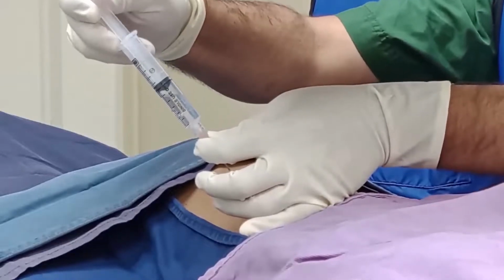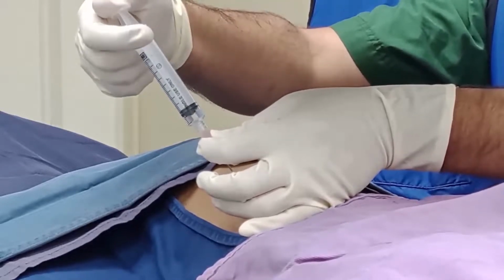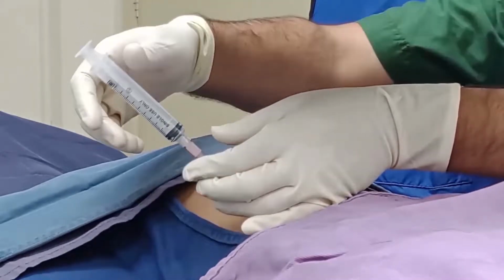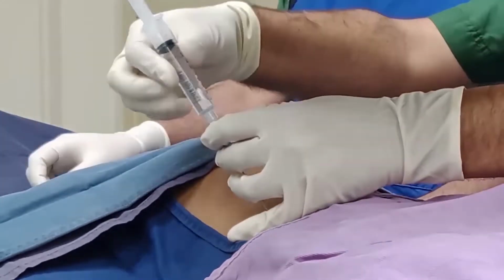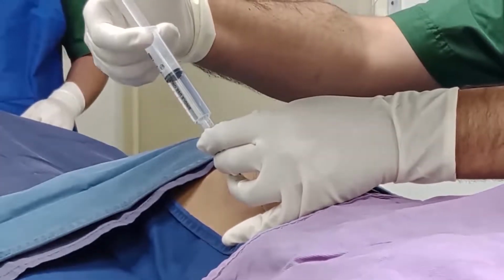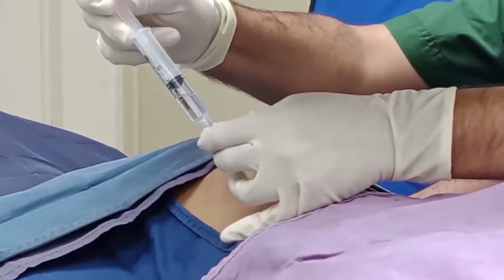0.25% bupivacaine is injected after aspiration for CSF, blood, and urine, since the kidney is on the right side as well. After waiting for a few minutes, the bupivacaine should have anesthetized and decreased the consequent pain of injecting alcohol. So 100% alcohol is being injected after again aspirating.